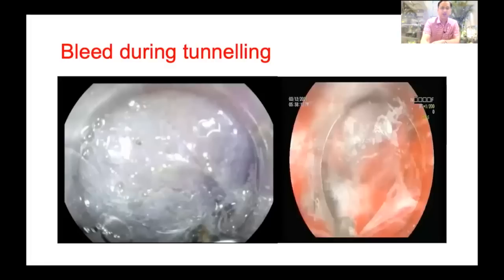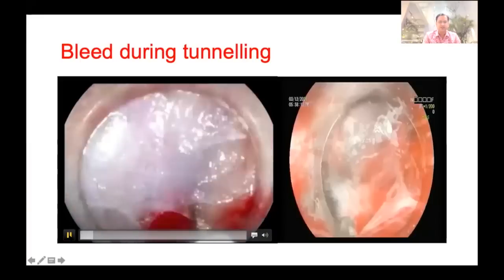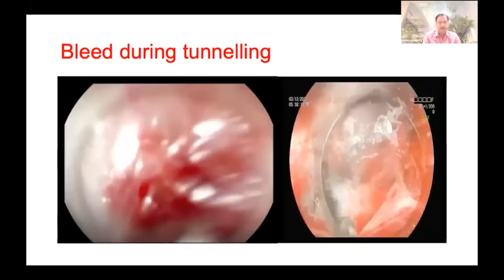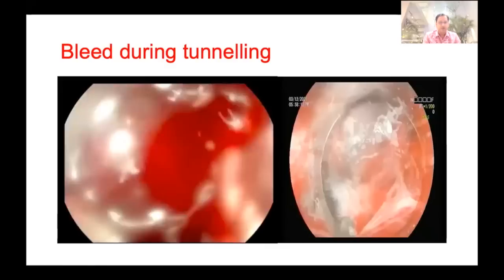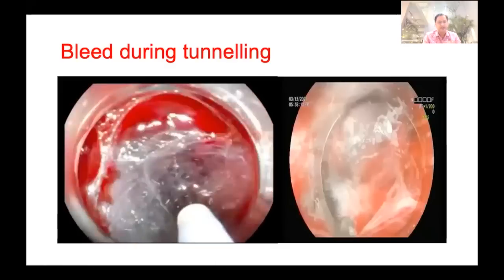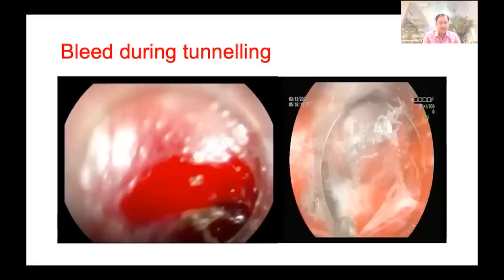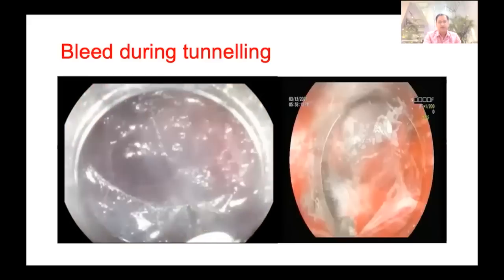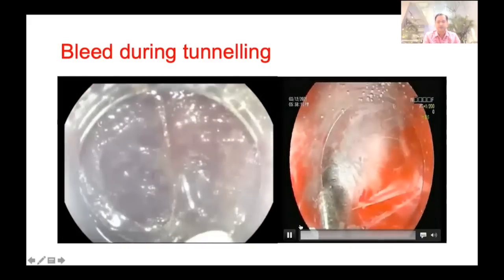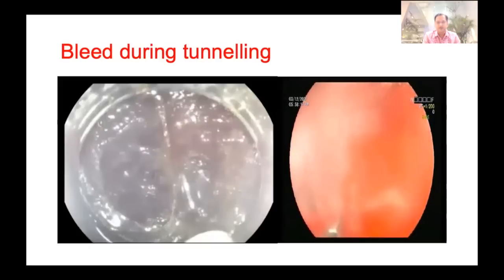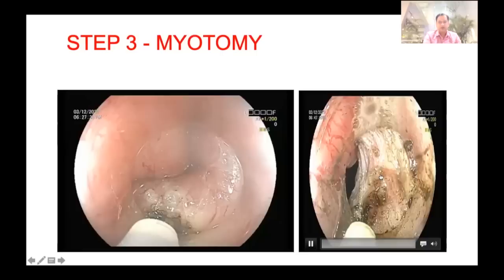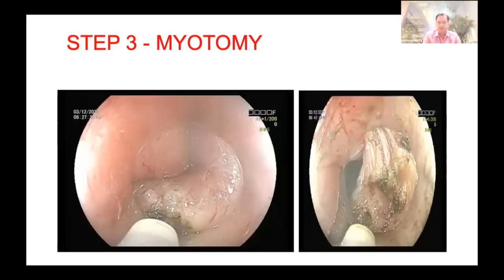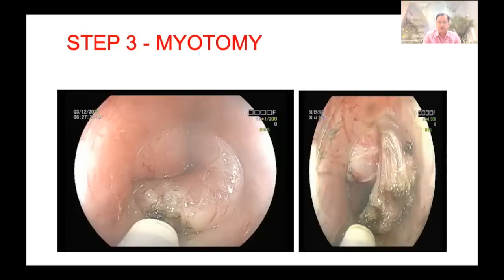Bleeding sometimes happens during tunneling. Here, when you do fast dissection, you can encounter bleeding in the submucosal tunnel. Because of inadequate dissection you are not able to identify the exact site of the bleeder, so I try to control with the coagulation grasper. Subsequently I dissect with the TT knife, identify the exact bleeder, and control the bleed with a few strokes of coagulation current. In another case, multiple bleeds happen simultaneously and are controlled by coagulation forceps. I am doing myotomy across the GE junction — complete myotomy — using coagulation current only, as the GE junction is very rich in vasculature.